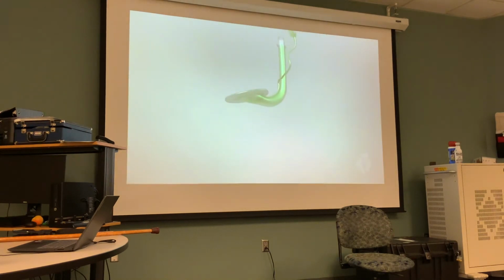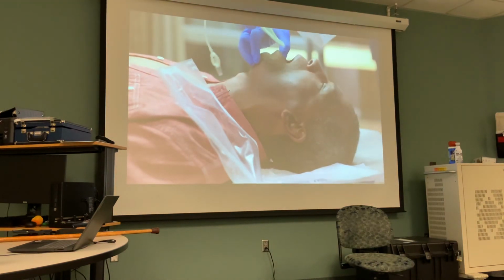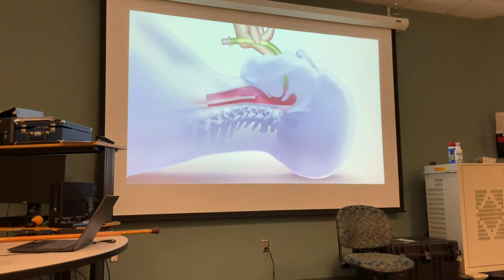The laryngeal mask airway is a tube with a distal inflatable cup shaped like a mask that is placed in the patient's hypopharynx. Place the laryngeal mask airway in the open mouth with the opening of the mask facing the patient's tongue. Advance the device to the back of the tongue. In a smooth motion, use your index finger to press the laryngeal mask airway against the roof of the mouth.